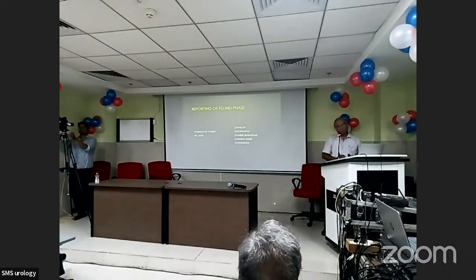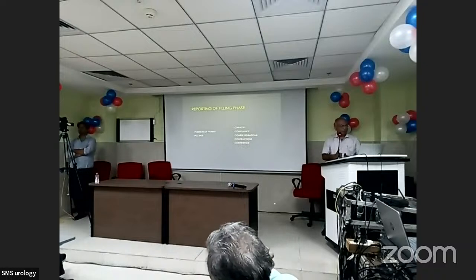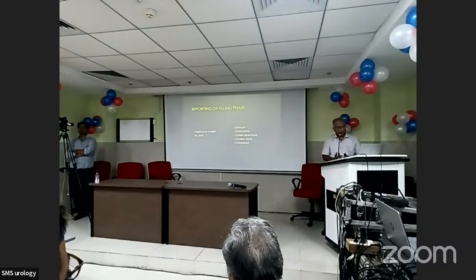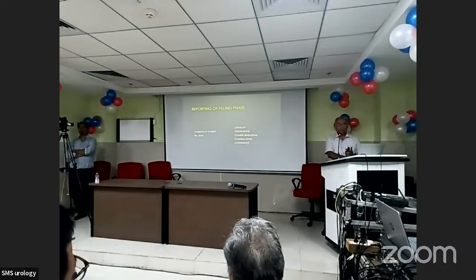So while we have to prepare a report of filling cystometry, what points should we include? Capacity, compliance, sensations, contractions if they are there, and the continence status, whether it was associated with stress or urge incontinence.